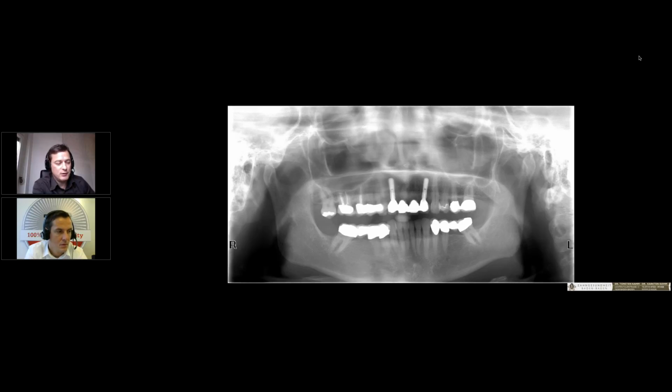In my practice, I use a special foil, like a rescue foil, and put it between the provisional crown and the other crowns. If I have only a little force on the foil, it's the right force for the provisional crowns. Okay, I hope this answers the question.